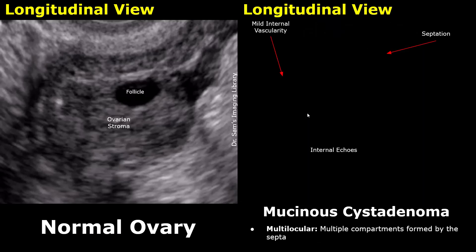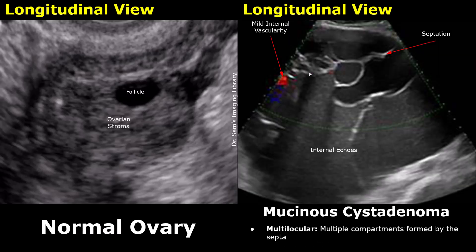This mass shows a large number of locules. These locules are closely packed together with small cystic spaces, whereas these locules are larger. You can also notice the difference in echogenicity between different locules. These two locules have somewhat medium-level internal echogenicity, whereas these locules have low-level internal echoes.